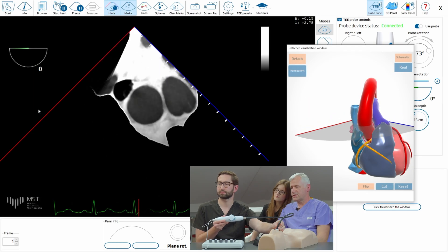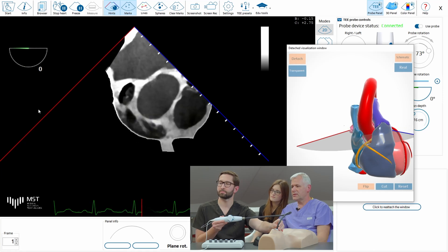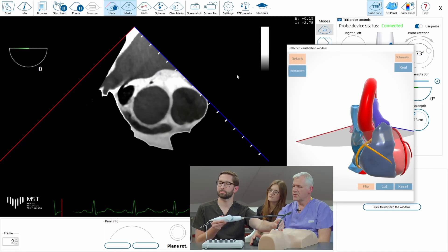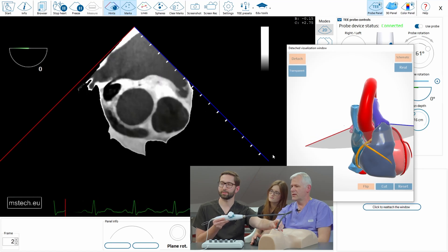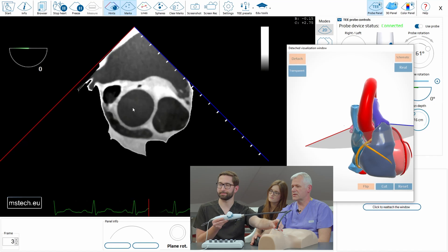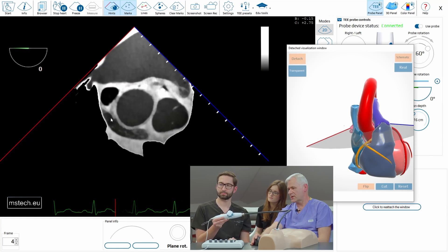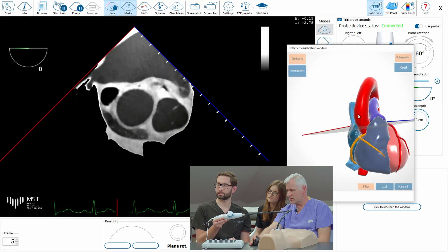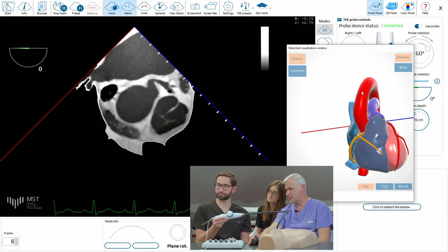So let's pass the ascending aorta. You see something strange here? What is this? Coronary artery, that's OK. But at the same time you can see that the aorta is not circular anymore, it's elliptic. Why is it so? Because the aorta is now bending here towards the left ventricular apex direction.